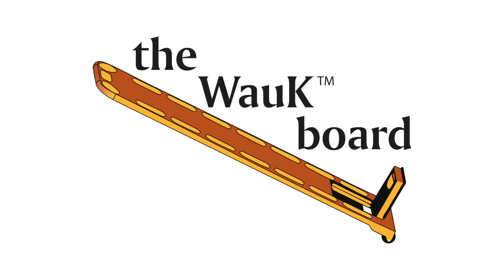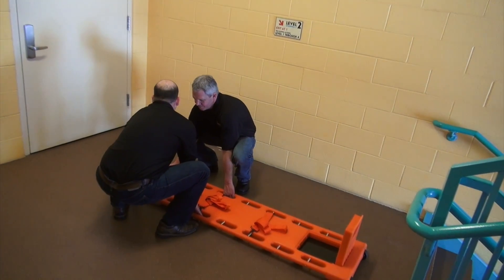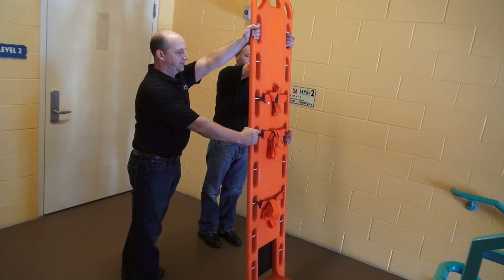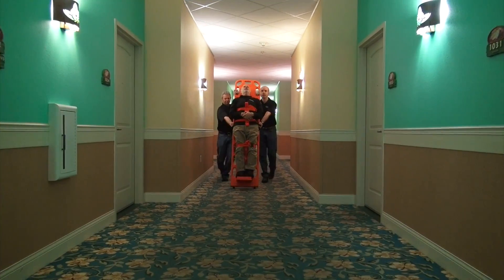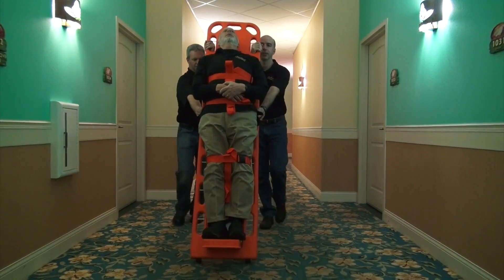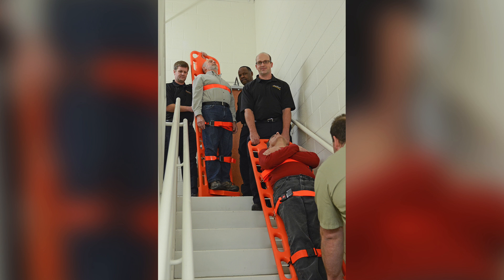How to use a walkboard. When used properly, the walkboard prevents painful back injuries that impact first responders. The walkboard allows you to roll a supine patient through tight places, into elevators, downstairs, and more.